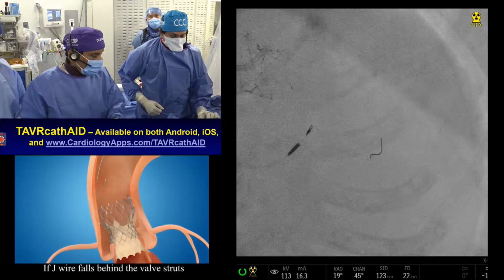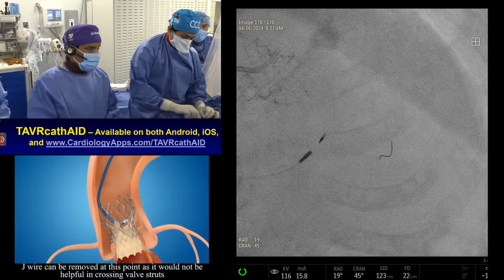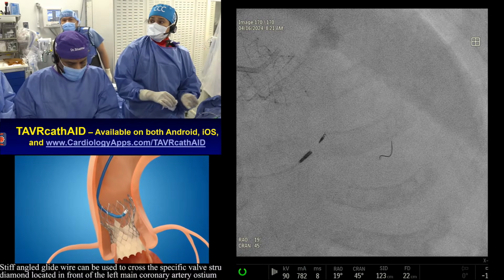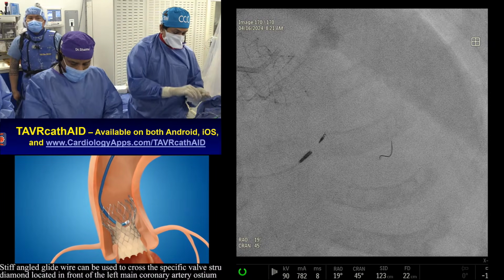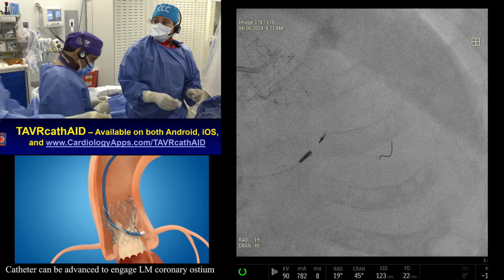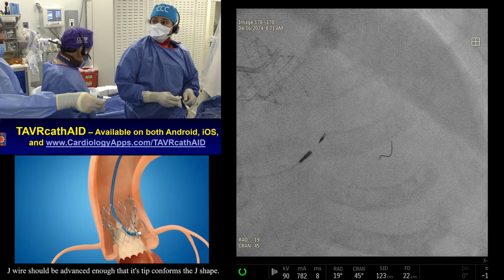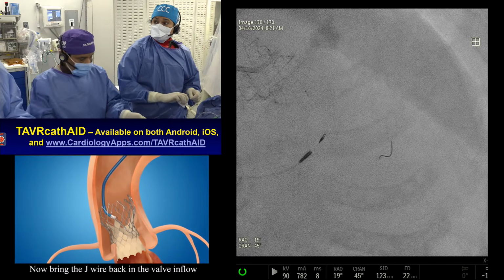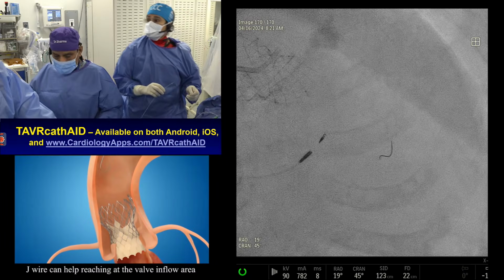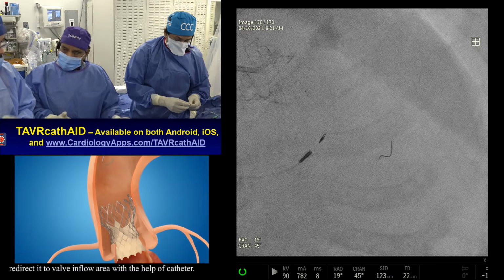So this LAD lesion is new; we found it in February of this year at the time of the TAVR placement. But the diagonal lesion of 60% was there, maybe 60, 70. The RCA total was there at that time, and the patient has done well since then. So a new change was this lesion in the LAD. Yes, it's surprising it became so much more significant in such a short time. Sorry, I'm talking about the first angiogram, which was in 2016. The LAD was not there then. But this lesion we saw in February. The LAD lesion was there, but we said let's do medical therapy.